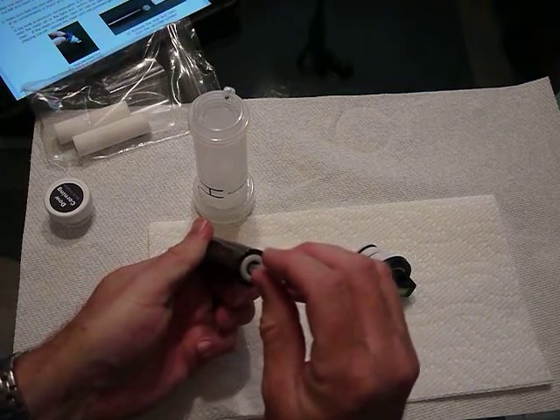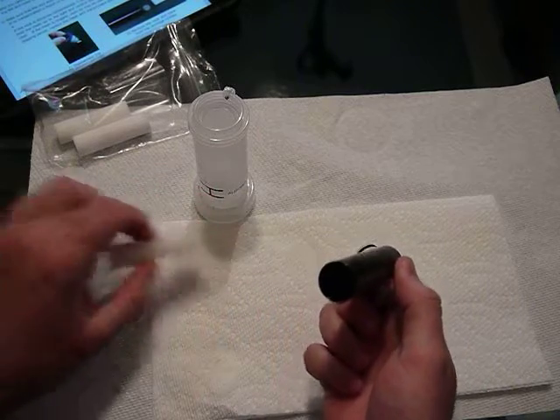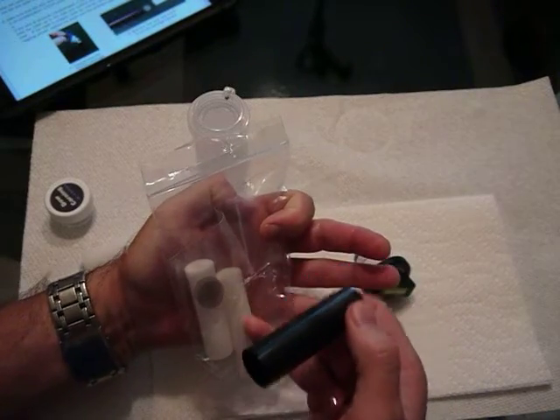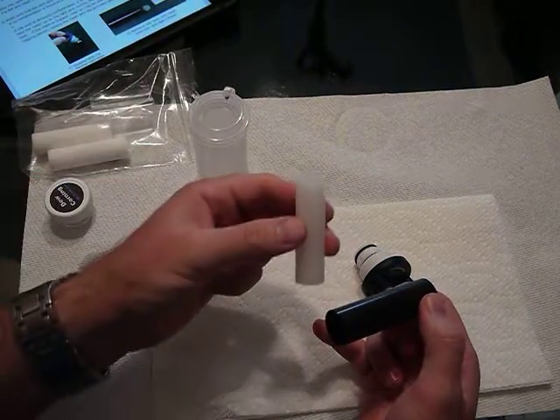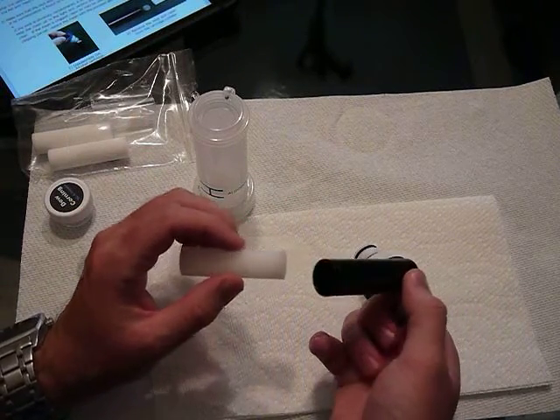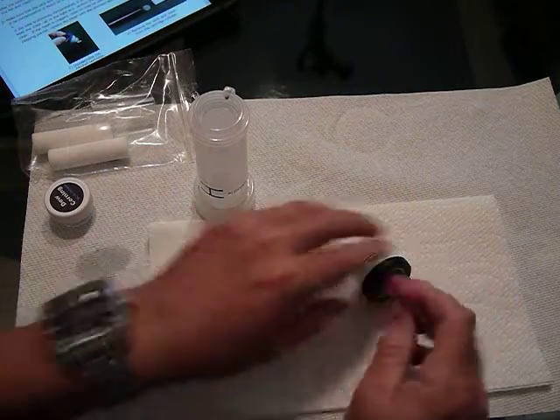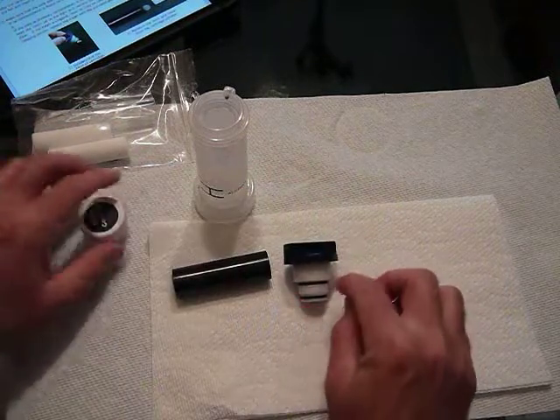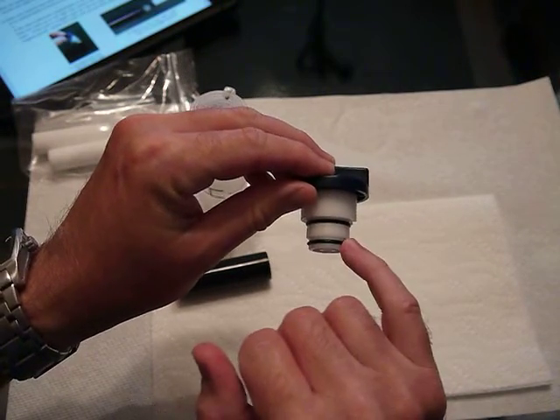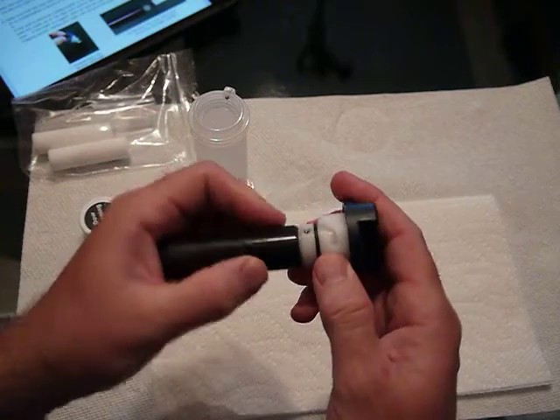If I wanted to remove that, actually the mesh is still in place at the end here. The unit shipped with extra mesh pieces and extra felt, because say if this was contaminated with bad alcohol, I could swap it out for a fresh piece of felt in there. Anyway, I'll pop that back in here. So these O-rings: this larger O-ring seals the alcohol cartridge to the machine. This O-ring here seals this cartridge together.